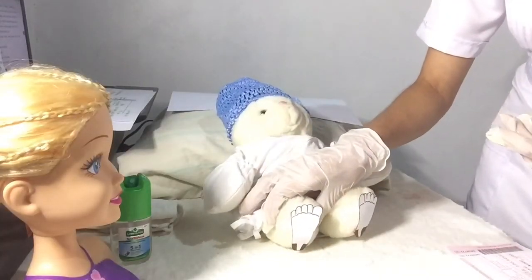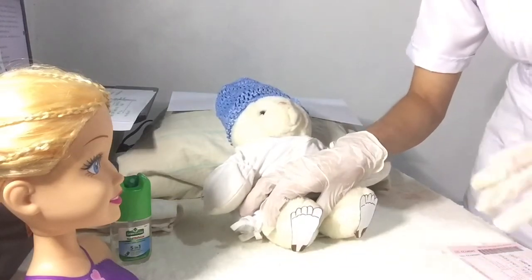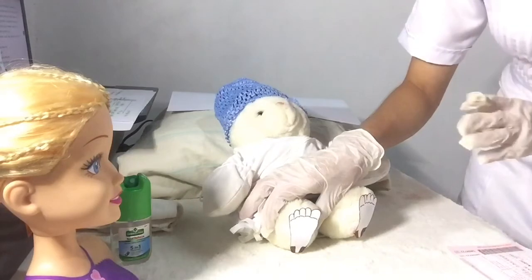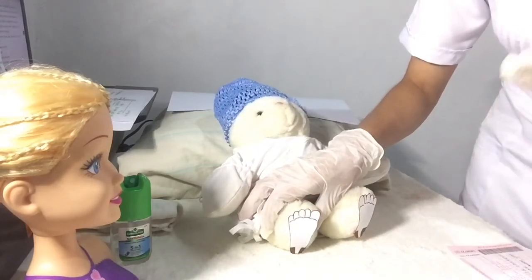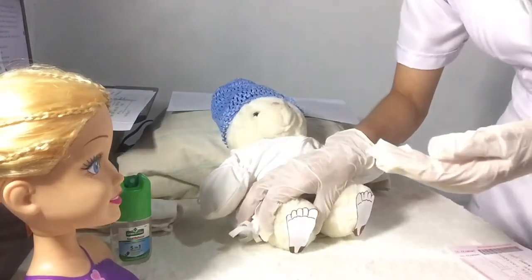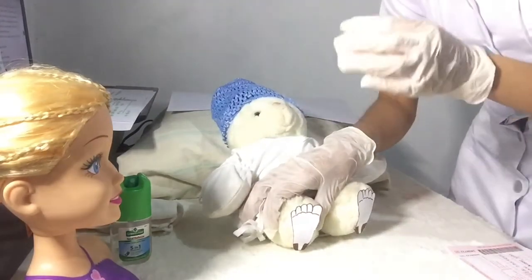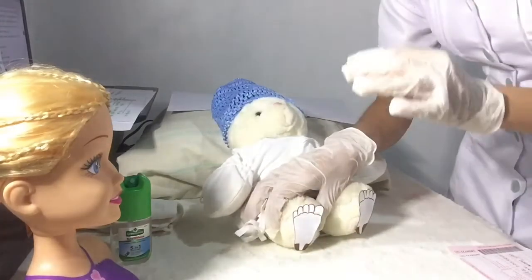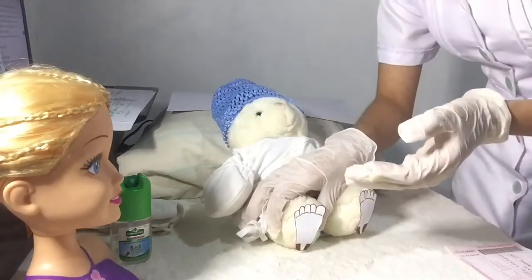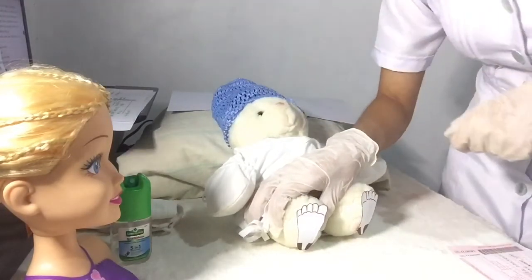So after that, we are going to hold in a dependent position and apply gentle pressure to facilitate blood flow. We should avoid yung excessive squeezing of the heel, kasi it might cause hemolysis or contamination of the specimen. So yes, after that, we have to make sure na sakto lang yung blotch ng blood sa bilog, kasi sometimes ma-reject ng machine kapag di sakto sa bilog, okay?